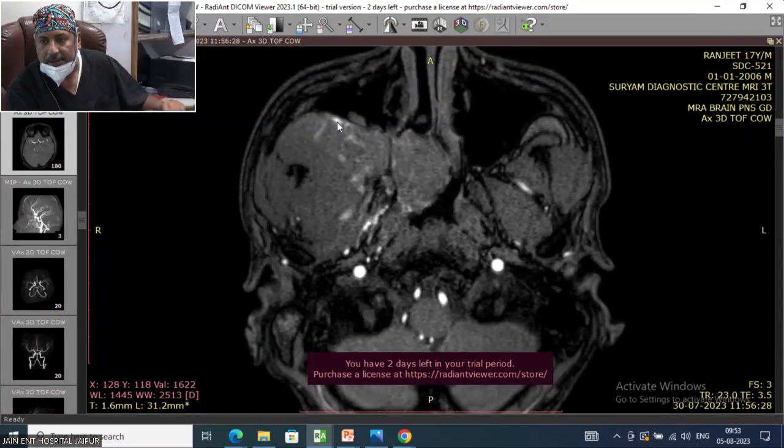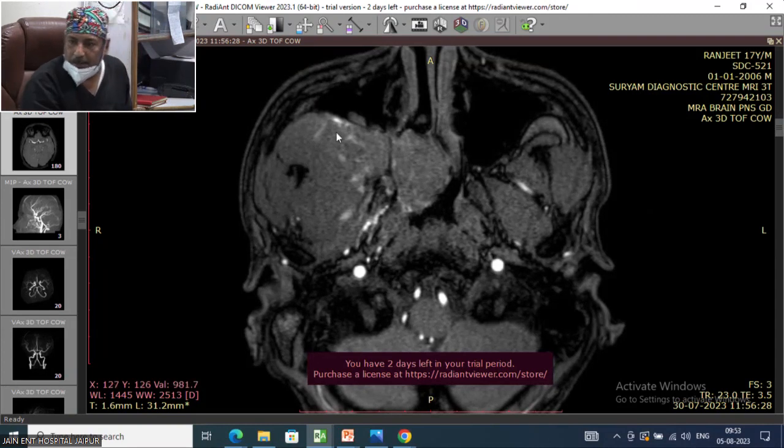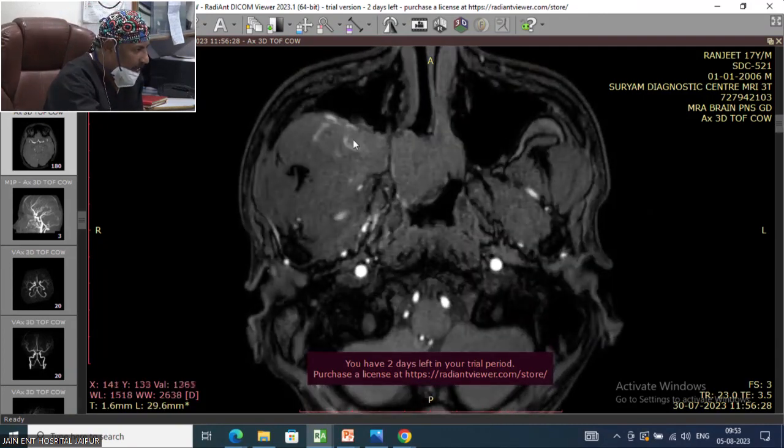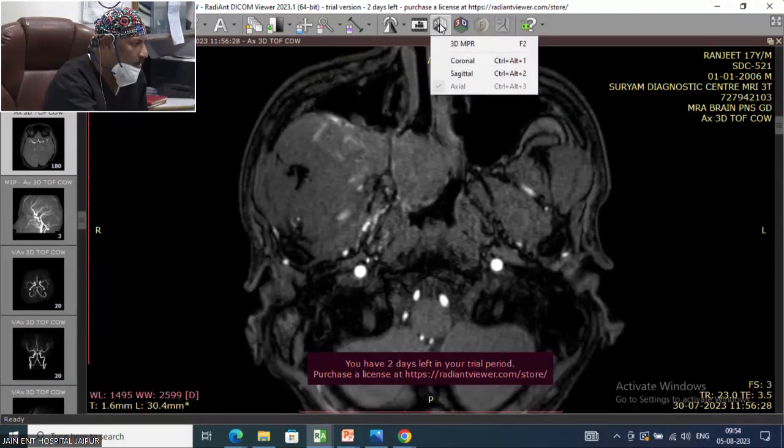That is the basis of endoscopic excision, where you come by the Denker's approach directly onto it, open up the posterior wall periosteum behind the maxilla and catch the vessel first to devascularize to a certain extent. This is the principal vessel, and see how much branching it is giving in this tumor to make it so vascular. That's the principal vessel which you have to catch over here.